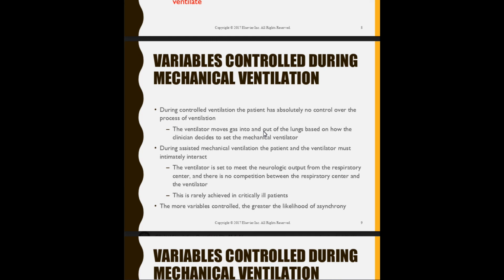And then your diaphragm says, "Hey, I didn't get a message, but we're getting air." Okay, we're just going to sit here and chill. So that's where muscle atrophy can come into play, because they're not doing anything. Now with SIMV, you're really making it work. Instead of them hanging out on the couch all day, SIMV is getting them back into shape. And when I say get back into shape, I'm talking neurologically and I'm talking muscularly in terms of the diaphragm.